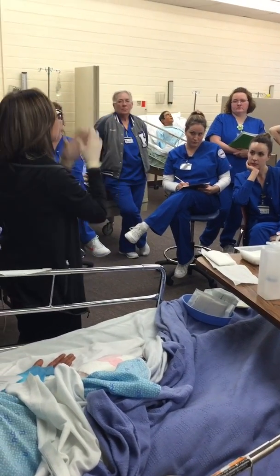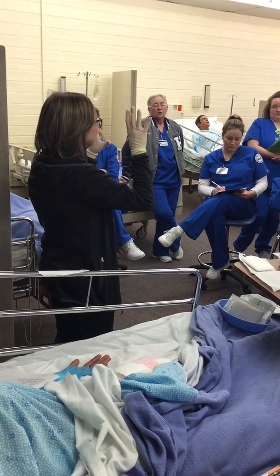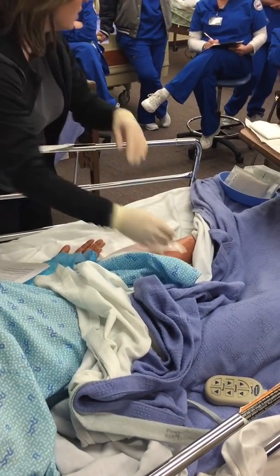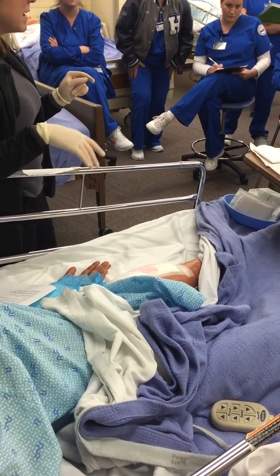Now I would put on clean gloves. So I'm putting on clean gloves. I have clean gloves on now. Okay? So I'm going to come over here and I'm going to take the dressing off. When you guys take the dressings off these, oh, you know what? You didn't give me tape. Oh, I got some right here. I didn't prep my tape.